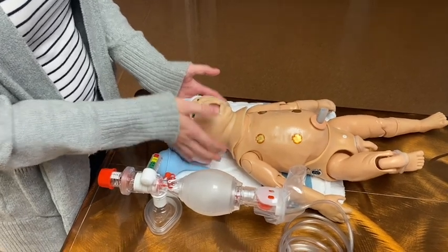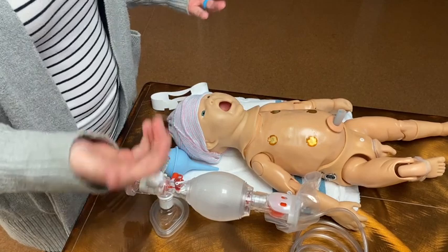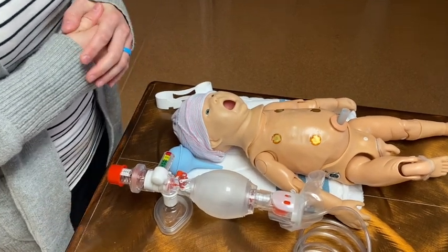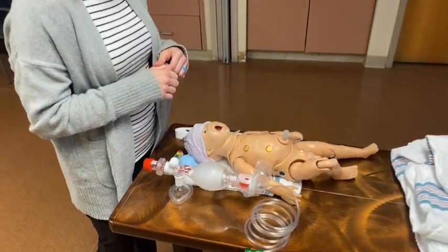If those things are not working and you've tried 30 more seconds of positive pressure ventilation, then you would go ahead and intubate the baby. For this baby, intubation is just as — if not more — important than chest compressions.